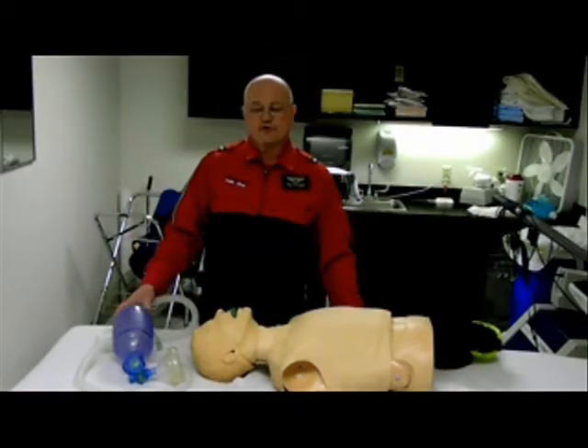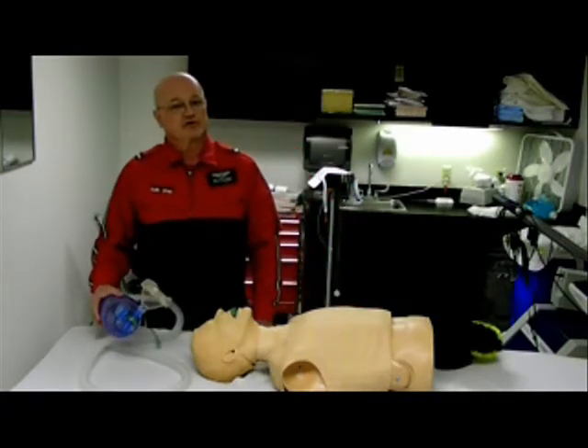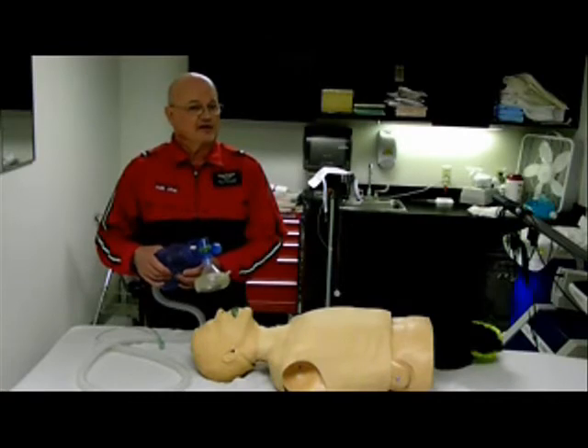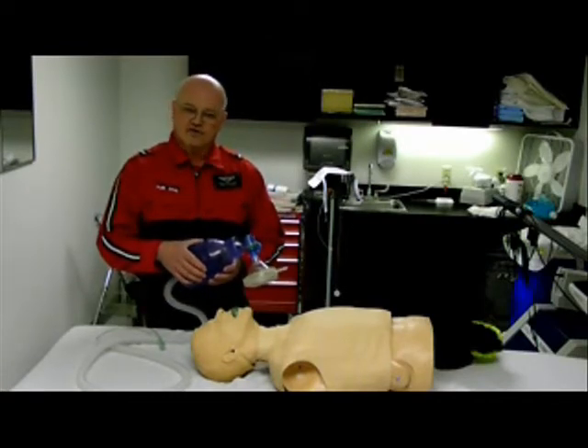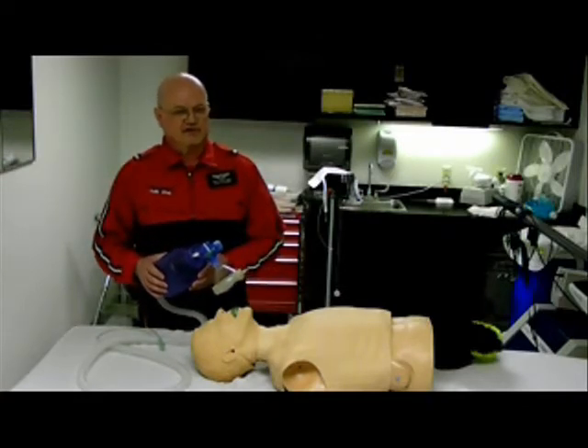If you have the opportunity to ventilate with one person or two, we want to choose two. One person can hold the mask, the other person can ventilate, but only halfway, slowly, one to two seconds, at a rate of 10 to 12 breaths per minute — that's one every five to six seconds.